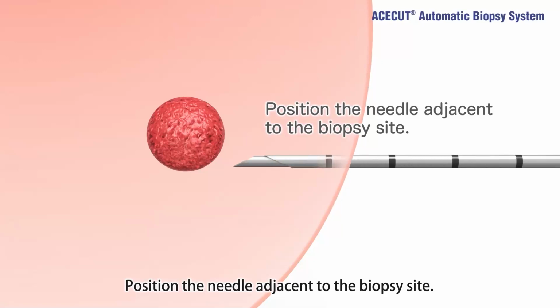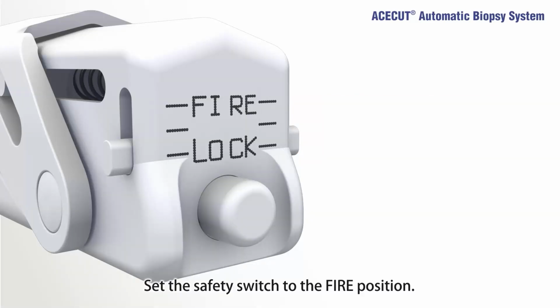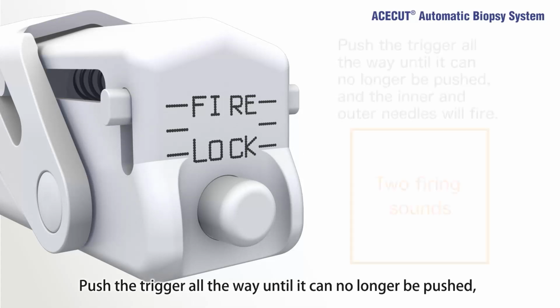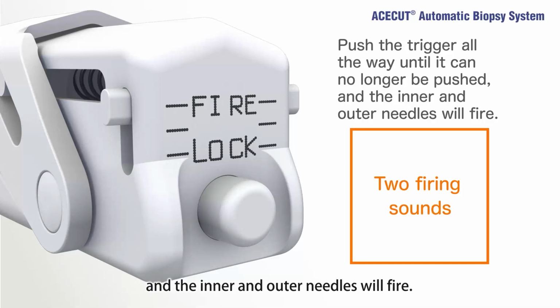Position the needle adjacent to the biopsy site. Fully automatic firing. Set the safety switch to the fire position. Push the trigger all the way until it can no longer be pushed, and the inner and outer needles will fire.